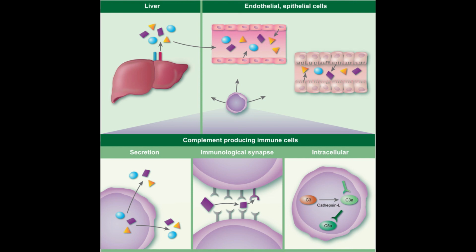Complement fixation tests use complement as a reagent to detect the presence of antigen or antibody. Antigen and antibody are allowed to combine with a measured amount of complement. Then indicator sheep red blood cells are added. They are coated with hemolysin, anti-sheep cell antibody, and if complement has not been tied up in the first reaction, then lysis of the cell occurs. Thus, lysis is a negative test, indicating that either antigen or antibody was not present. As in all complement testing, the use of standards and controls is necessary for accurate results.